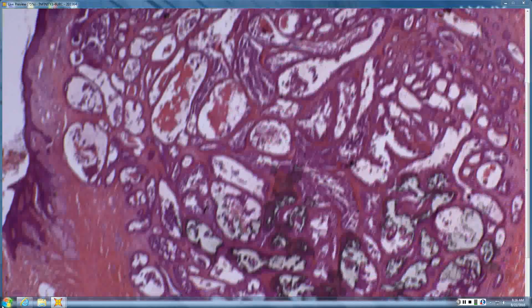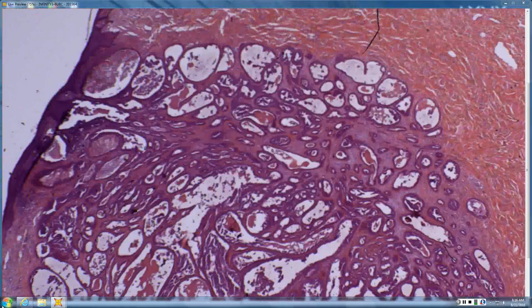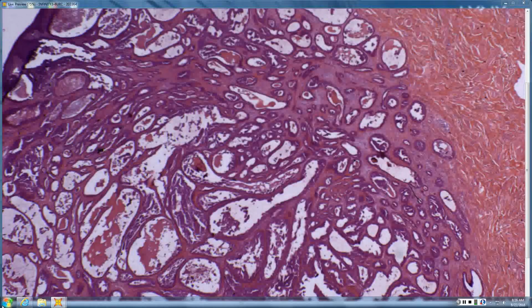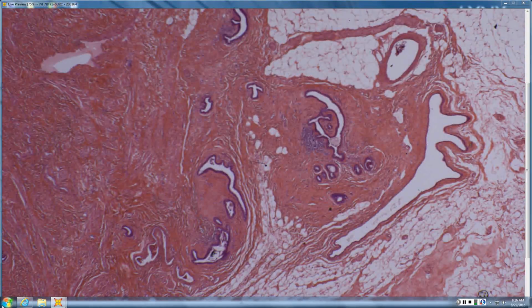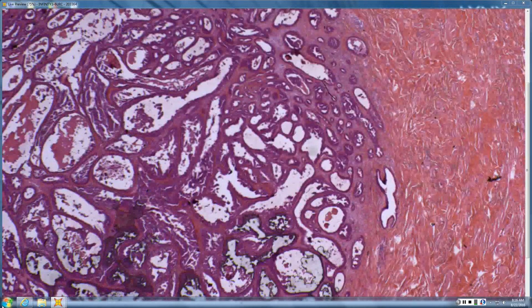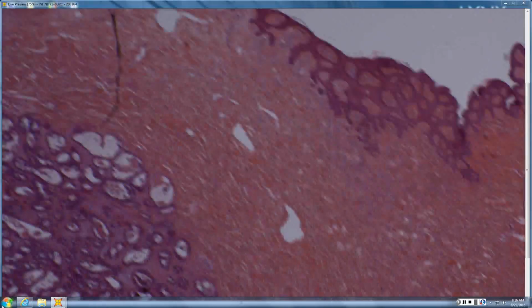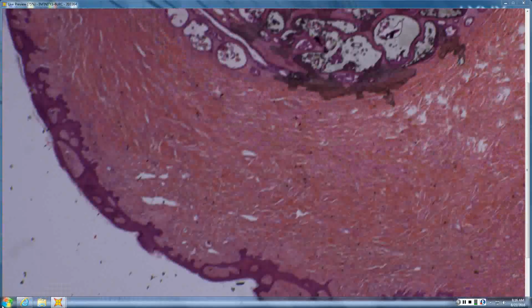So, a pretty well circumscribed dermal nodule. It almost looks like it connects to the epidermis, although it has largely a kind of maze-like architecture. Kind of HPAP-like, right? And what's down below it? There are some ducts and lobules, and it appears to be breast tissue. So that is mammary-type tissue. So, nipple adenoma. And when you look at it, you can see grossly that it's sitting in the nipple, right? This is a nipple protruding upward, and this is within the nipple.